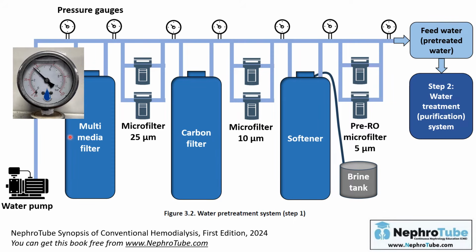if the difference between the two monitors here and here is 1 bar or more, so we start to make backwash for the tank, or even maybe change it according to its condition. And what is backwash I will mention later.